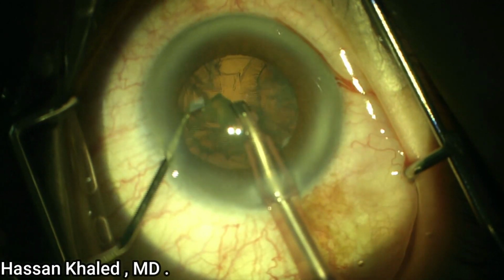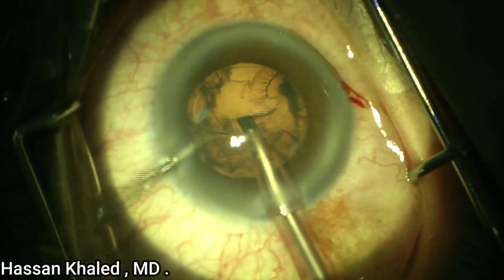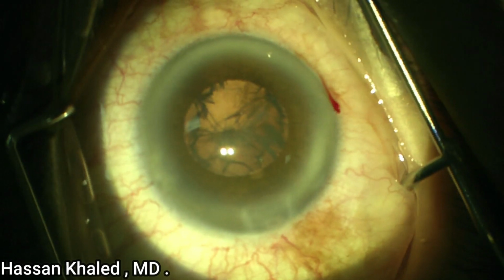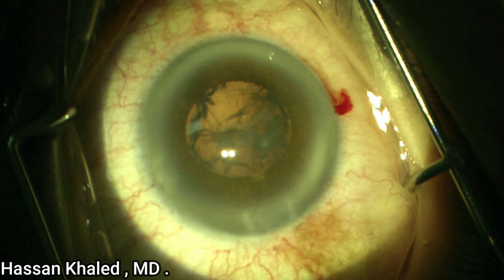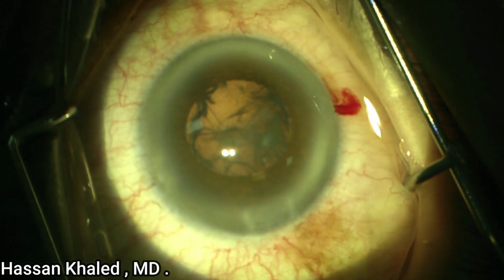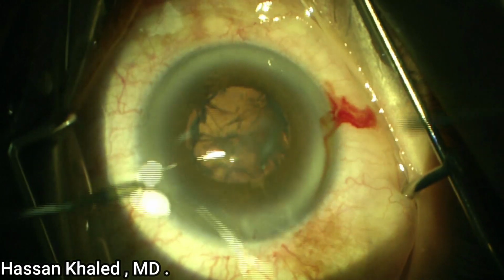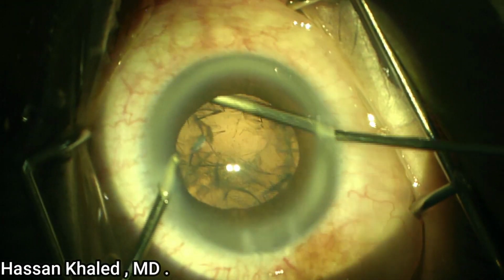Now the time of cortical removal. Here is a bimanual irrigation aspiration. You can see the irrigation aspiration go through the paracentesis. Introduce the irrigation first, form the capsular bag and the anterior chamber.